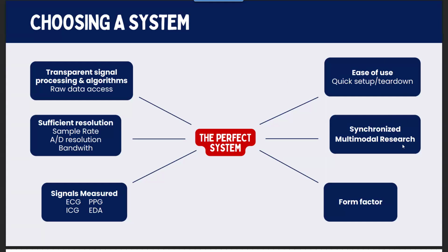With this, we are able to get metrics reliably like heart rate and pulse rate variability, but depending on the actual PPG device itself, we need to consider what you're able to access across these various devices in order to know if it's a good solution for you. So, grounded in your research question, whatever your analyses may be, we need to consider how that translates to the physiology and our points of interest.